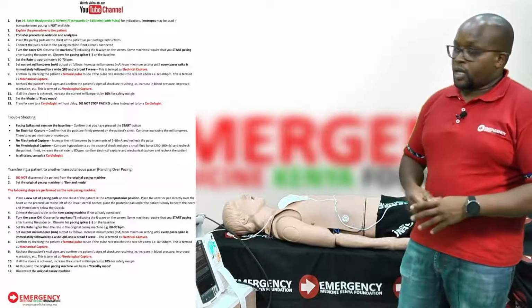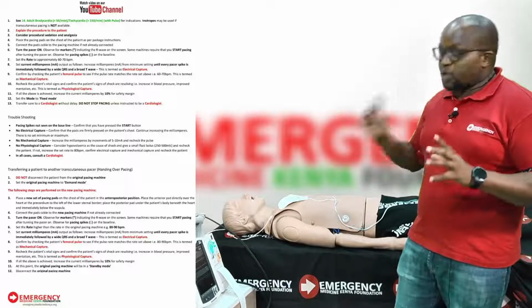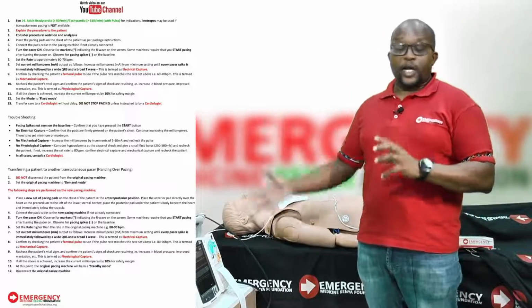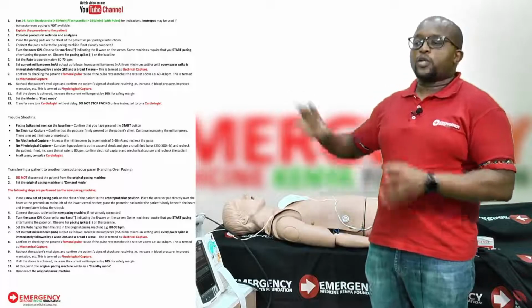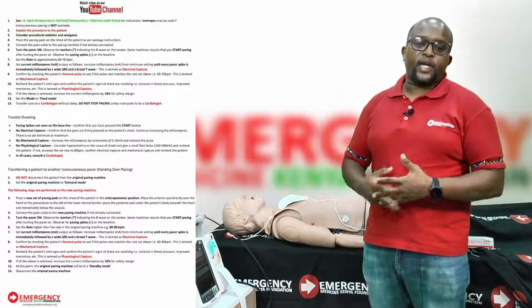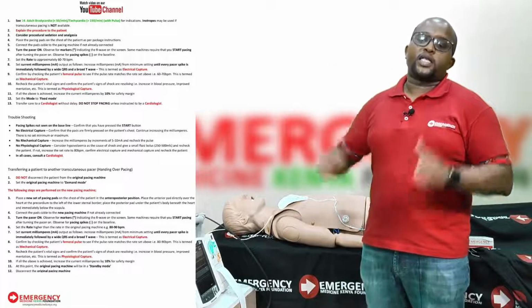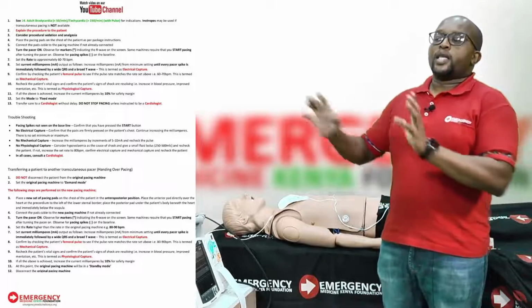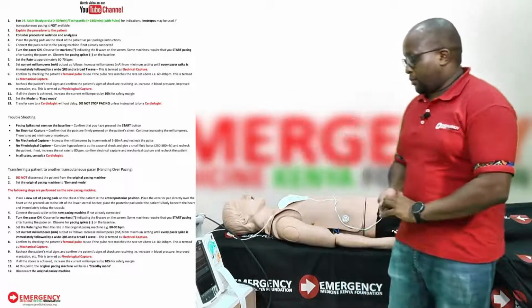Now, the other thing I want to mention is that once you start pacing a patient, you normally will not stop pacing the patient unless you're a cardiologist who will then do all the cardiology things that they do. So as an emergency care provider, once you start pacing a patient, do not stop pacing the patient at any point. The cardiologist will normally take over the pacing.